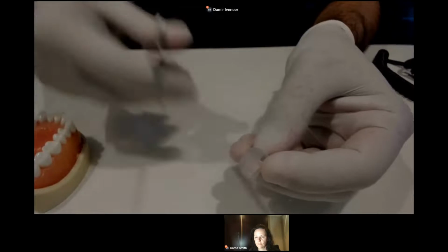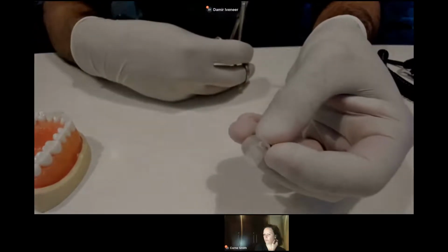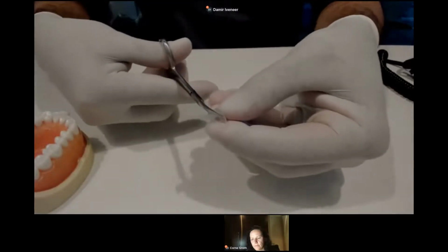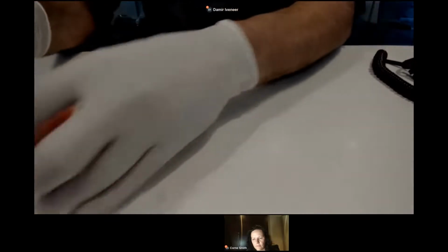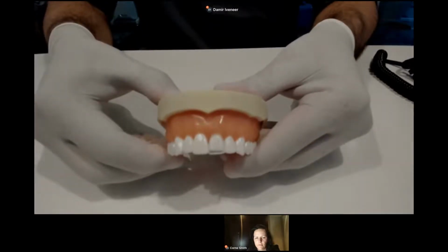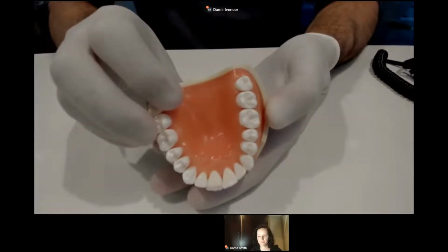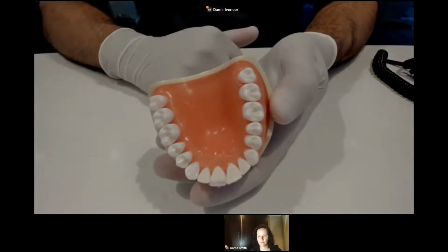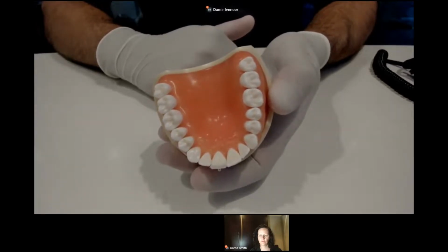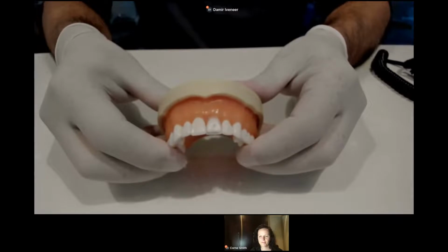And of course, we will release a clinical online course for everything I was talking about today. I cut in a circular, half circular motion, and I leave the interproximal. And then I can take the matrix, put it again, and make sure that it sits in the correct way, buccally, incisally, and from the palatal, before I close this opening. You will please excuse me because I forgot the curing light and you will kill me, but I will show you how without it, okay? And this is the way we do it.